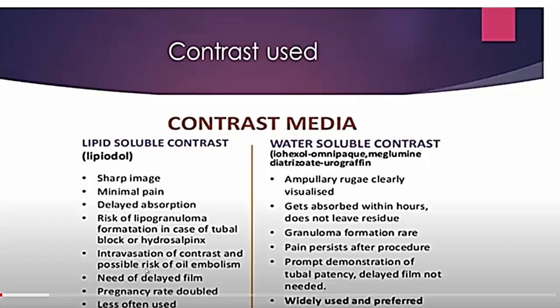With the lipid-soluble contrast, we need a delayed film after 24 hours. But here we do the control film after only 15 to 20 minutes. The water-soluble contrast is widely used and preferred because, as I said, the lipid-soluble contrast is not available. The pregnancy rate is doubled with the oil-soluble contrast.